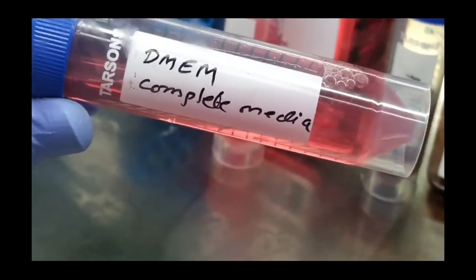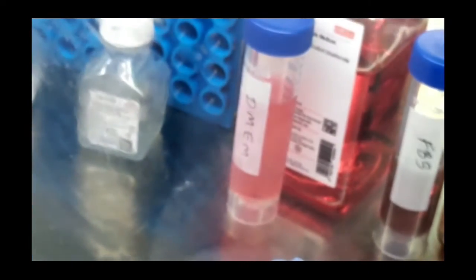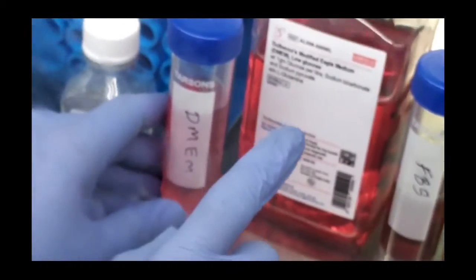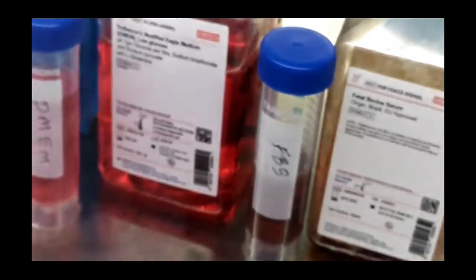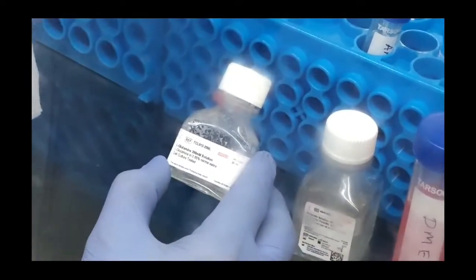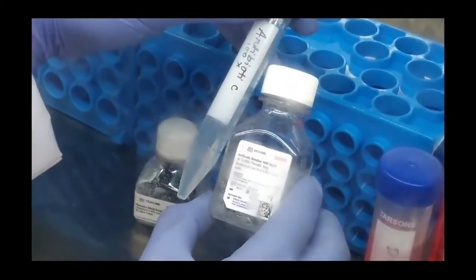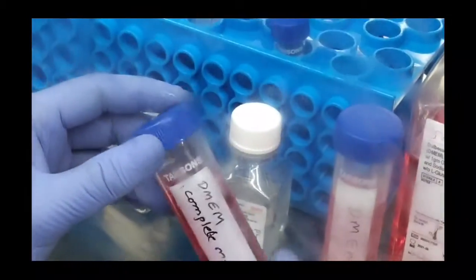So we have prepared a complete medium with a volume of 40 ml. In brief: we have taken DMEM 36.8 ml, which contains all the nutrients along with glucose. Then we have added FBS 2 ml, which makes it 5% FBS. Then we have added glutamine 0.8 ml, making its final concentration 4 millimoles — its stock is 200 millimoles. Then we have added antibiotic, which is a 100x solution, and we added 0.4 ml, which makes it 1x. Our complete medium is now ready with all the essential components inside.